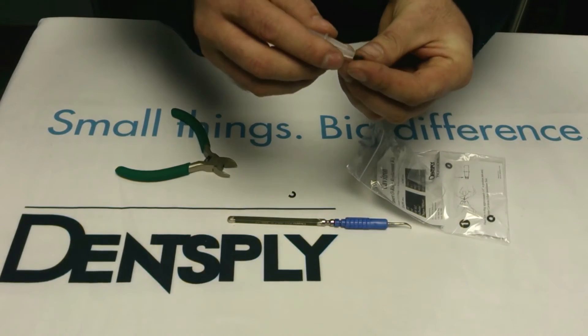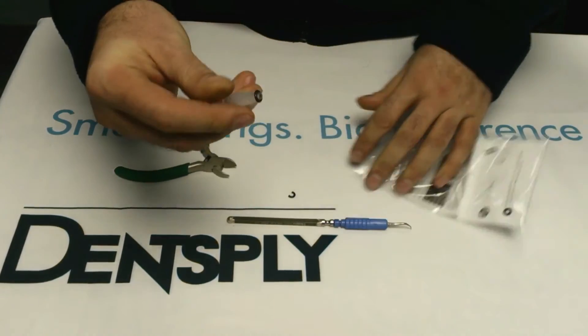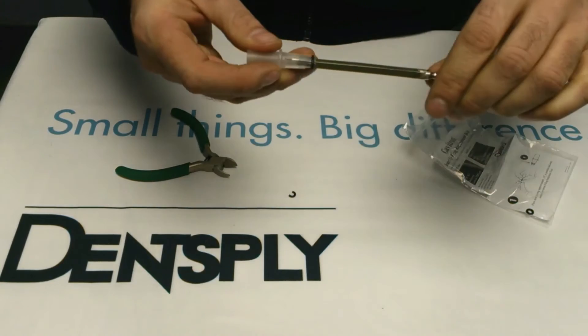First of all, you place the o-ring on the end of the installation tool like so, and apply it gently to the end of the insert and provide firm pressure.